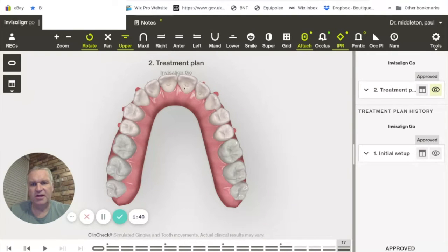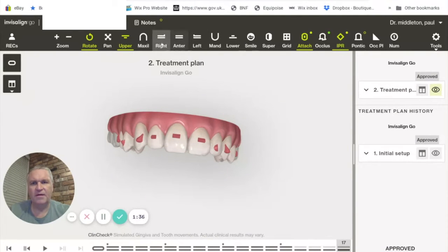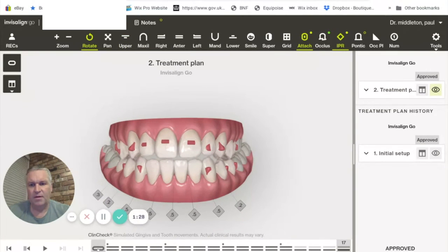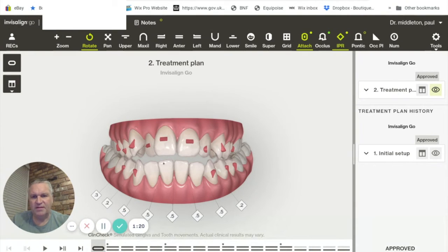So this is the Clincheck, and this is the next stage we would look to go to after the initial scan. And the other thing to note about the Clincheck is that we can alter things within certain parameters. When this case first came back from Invisalign, this space at the front here, which is called an anterior open bite, had been completely closed.